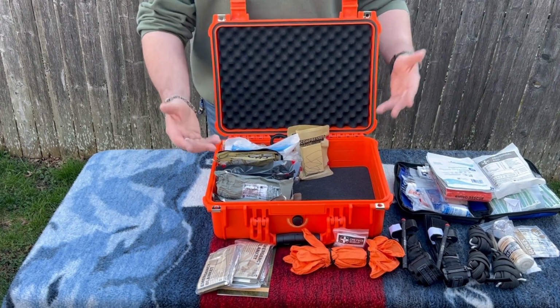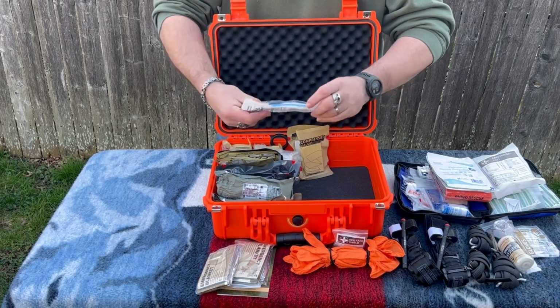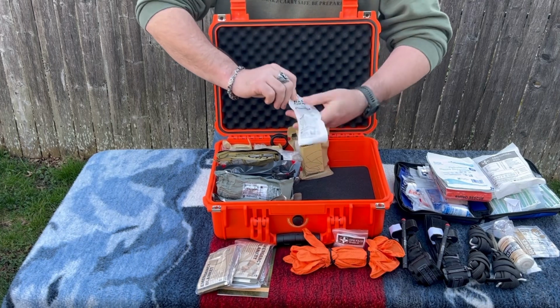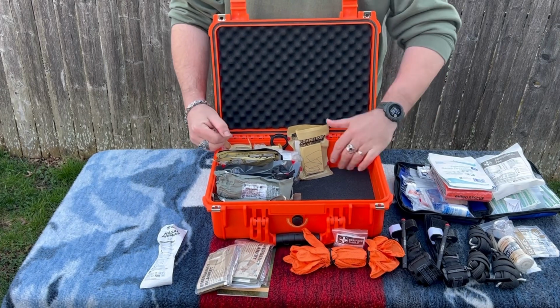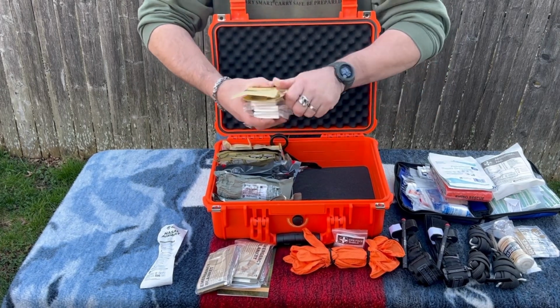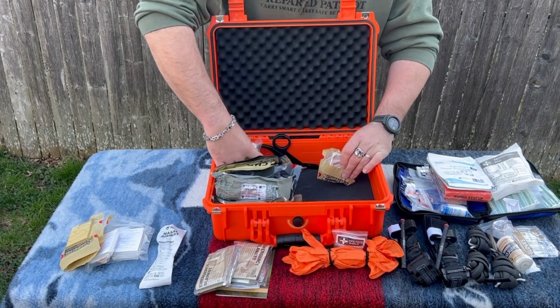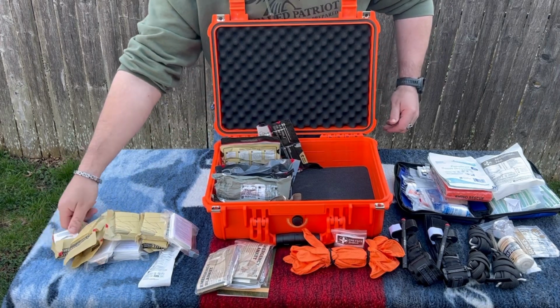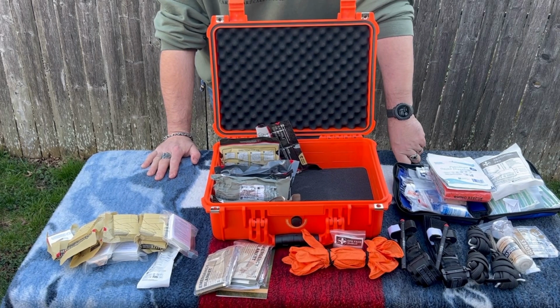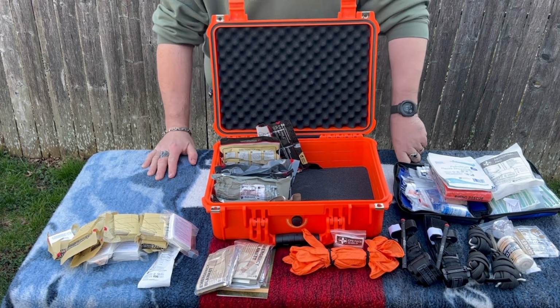Then we get into the nitty-gritty of trauma, right? There is an NPA. There is a jelly in here, but I'll probably be including some others as well. I've included several packages of compressed gauze. Why have I included several packages of compressed gauze? Because I know someone who made the statement, you can never have enough gauze, which inspired me to create my gauze dispenser, and I have taken that information to heart.